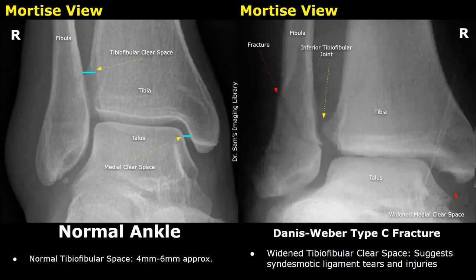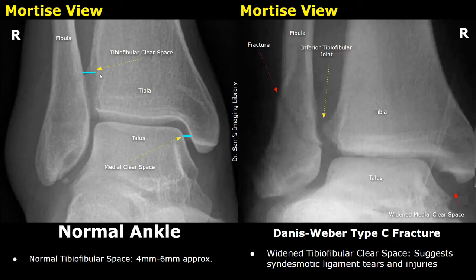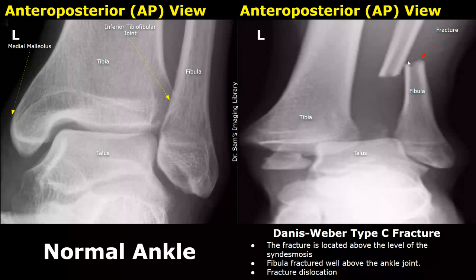Another important clear space to note is the tibio-fibular clear space, measured one centimeter above the tibial plafond — the space between the medial edge of the fibula and the tibia. Normally this space is between four and six millimeters. In this image, however, the tibio-fibular clear space is widened. This image shows a fracture of the fibula located above the level of the syndesmosis, making it a Weber C fracture. This is a very severe injury, and fracture dislocation is noted.